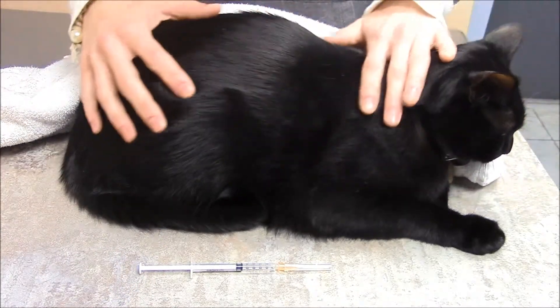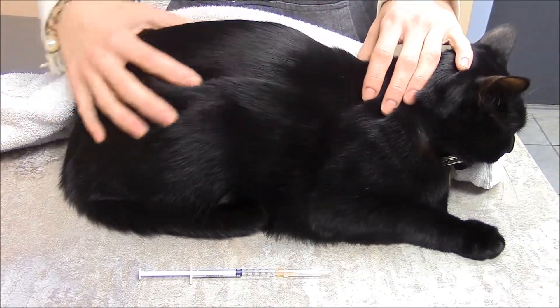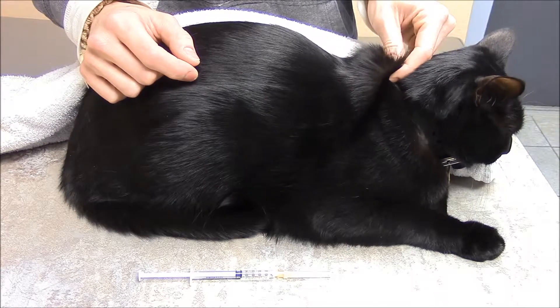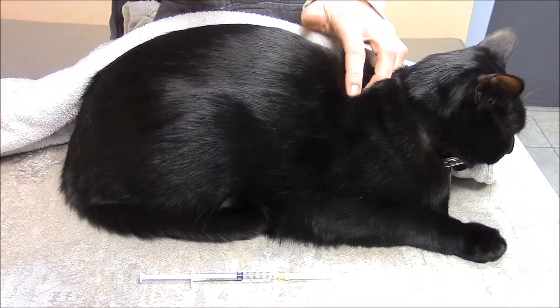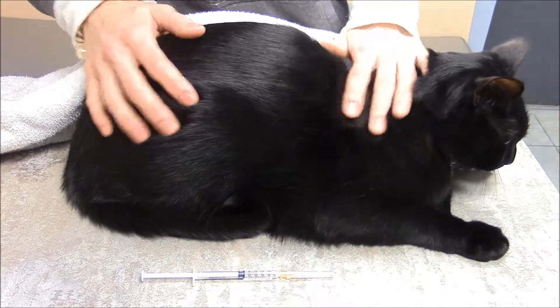To give a subcutaneous injection, you can give it anywhere along the cat's body, but the area over the shoulders has a lot more extra skin, so it's a lot easier to do and give the injection.